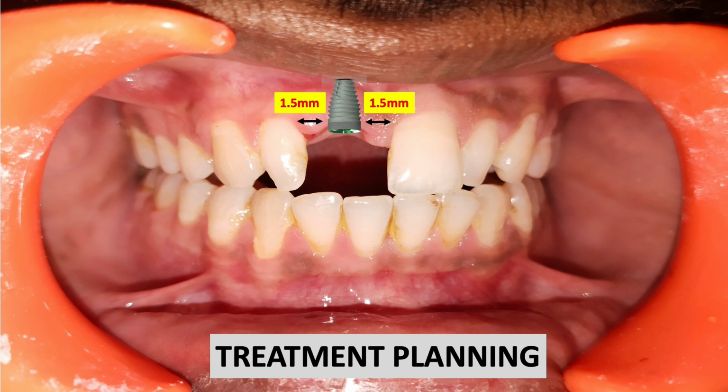And then how to select the height? As we have an ideal idea about the central incisor root length, according to that we can select the length of the implant, or by seeing the radiograph we can select the length of the implant.